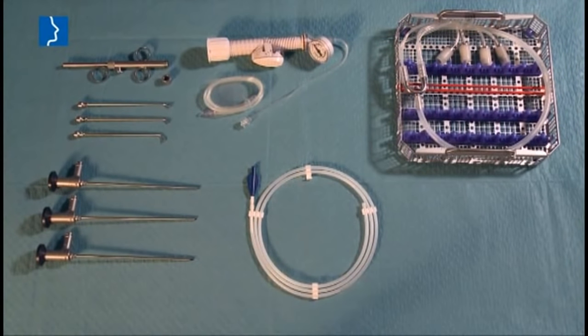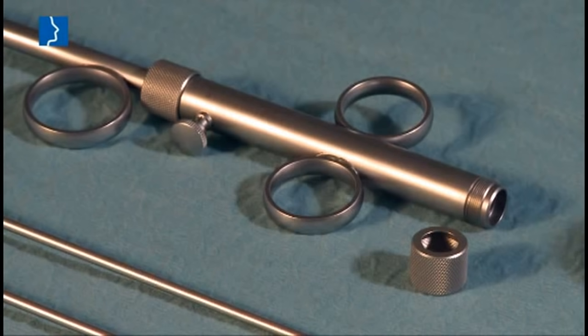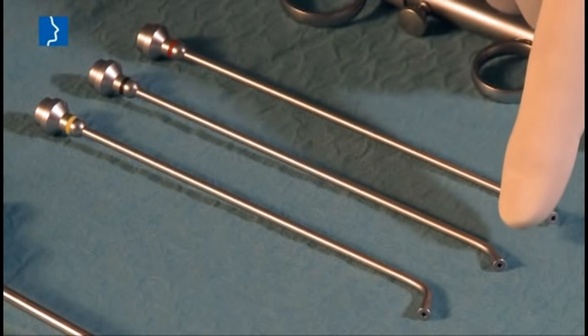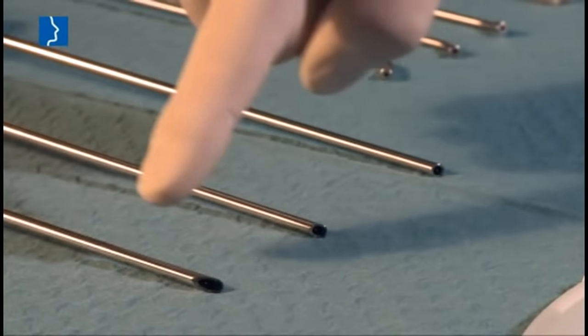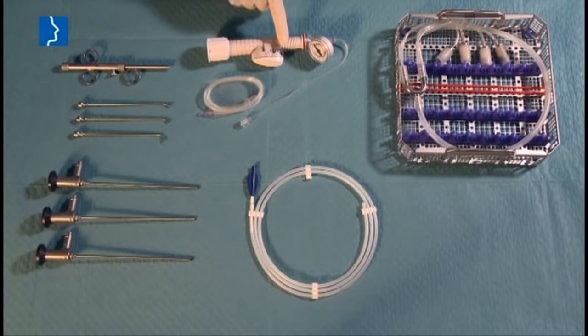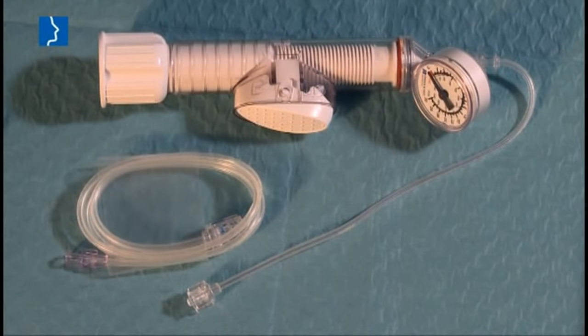The instruments for balloon dilatation of the eustachian tube using a specialized balloon catheter comprise a number of different components: the insertion instrument with defined advance, three distally tilted attachments and corresponding optics, and the inflation pump for single-use with pressure indicator and stop function and an extension tube.